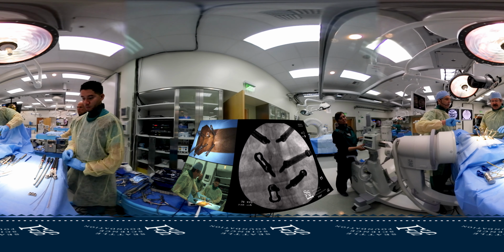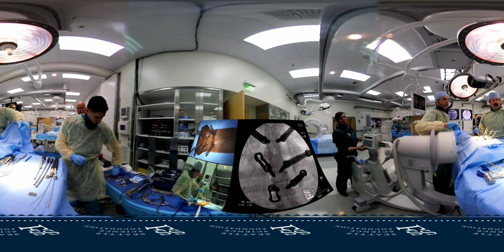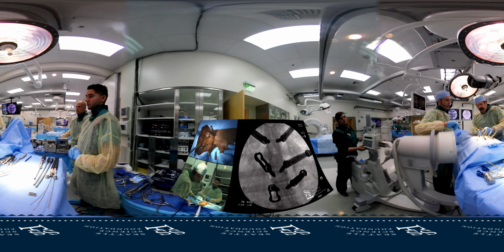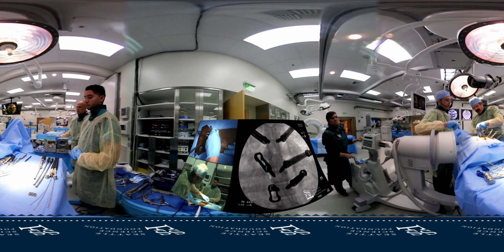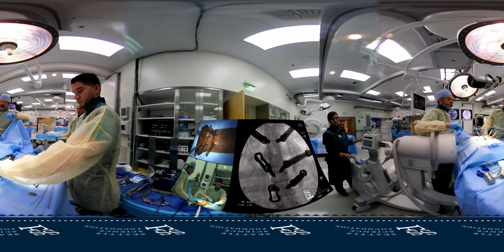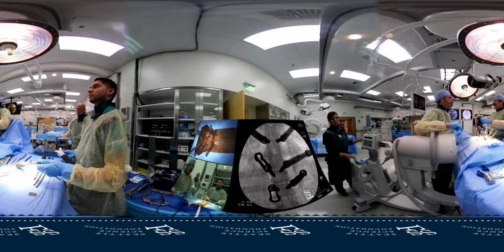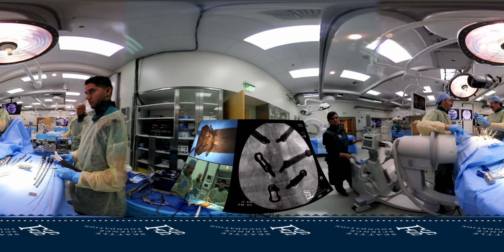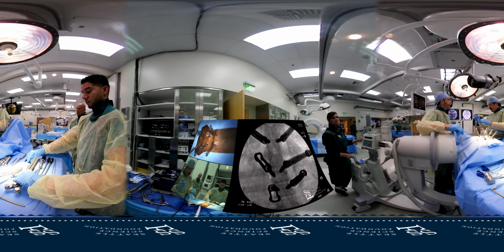And again, I intentionally don't make my holes any bigger than I need to until I'm ready. And so at this point, I don't know that it matters whether you pass caudal to cephalad or cephalad to caudal. I usually look at the patient and see what I think is going to work the best. And if you have an ankylosing spondylitis patient, you really want to try to contour your rod to match their kyphosis. And some of them are very hyperkyphotic. That can be very challenging.